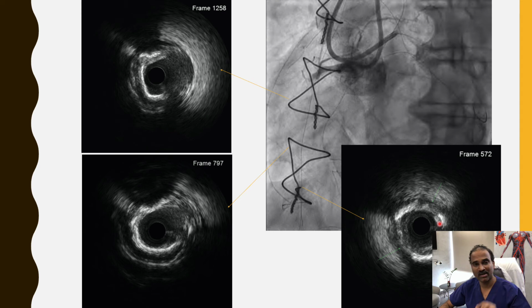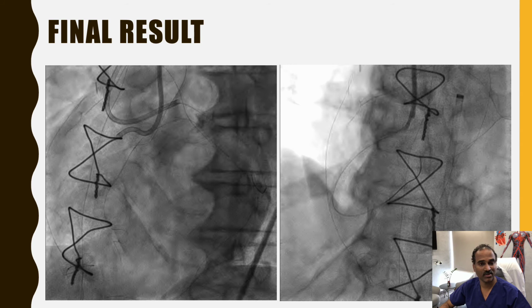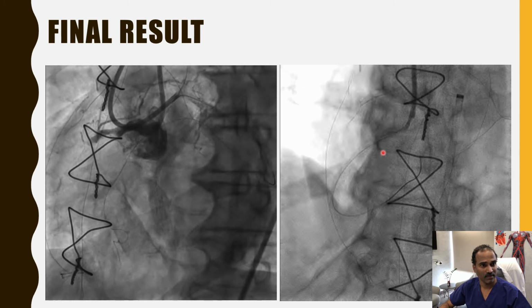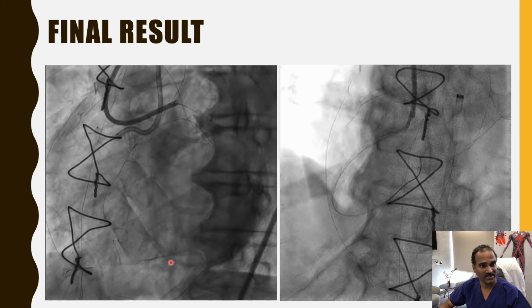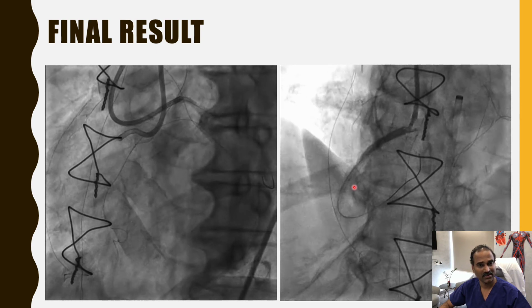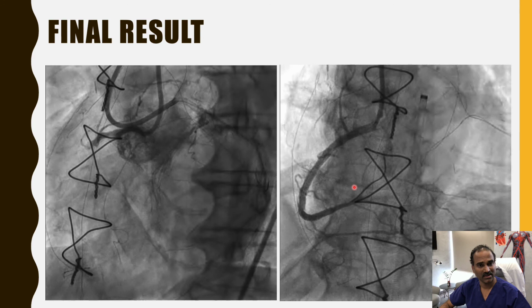So mostly the knuckle preferred to go through the intima rather than the subintima. We can also see good breaks within the calcium in these sections, which clearly says most likely there shouldn't be any issue with stent expansion. This is the first injection, and subsequently we stented this RCA with 3 stents, and you can see this is the final result.